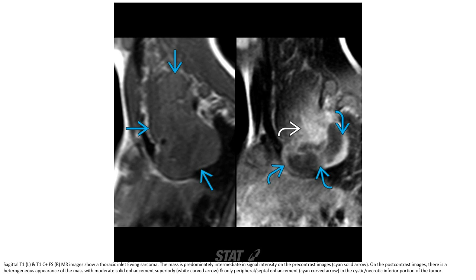This is the MRI image of the same patient. The thoracic inlet involvement is common. The mass is predominantly intermediate in signal intensity on the pre-contrast image. On the post-contrast image, there is a heterogeneous appearance of the mass, with solid enhancement superiorly and only peripheral enhancement in the cystic-necrotic interior portion of the tumor.